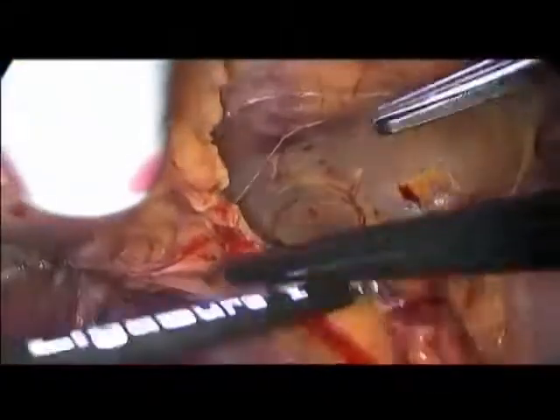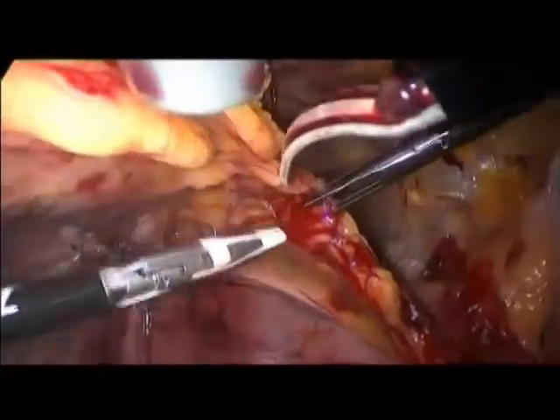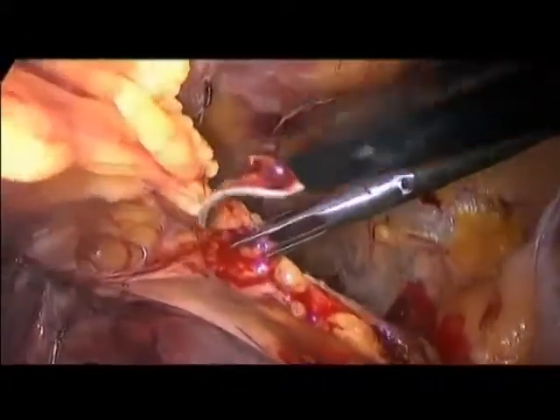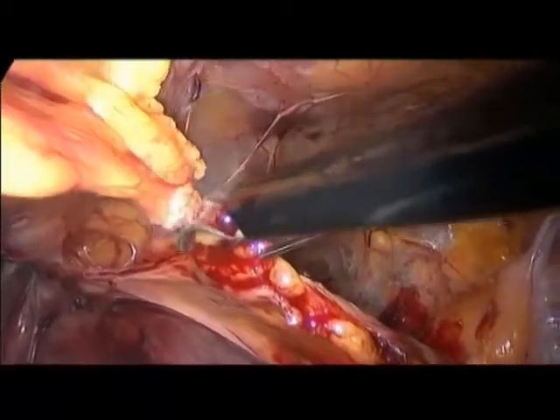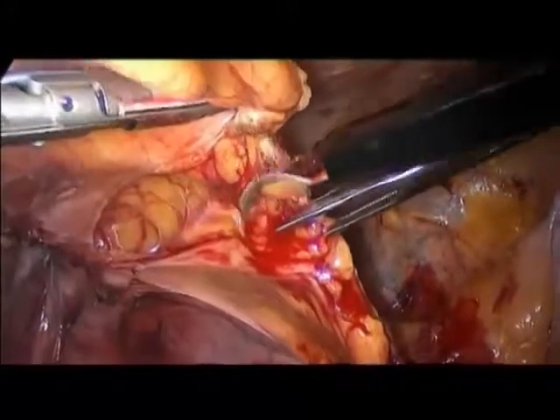Roland, there was a discussion that you are performing a lymph node dissection afterwards. Has this any impact on your incision lines now at this point, whether you perform lymphadenectomy or not? At this moment, not, because I could.